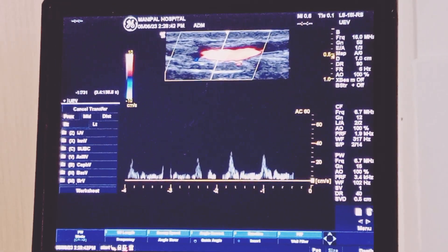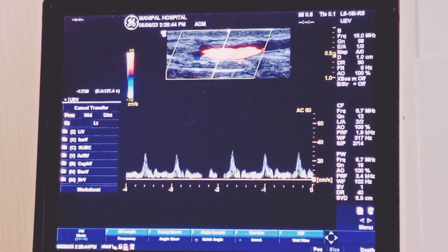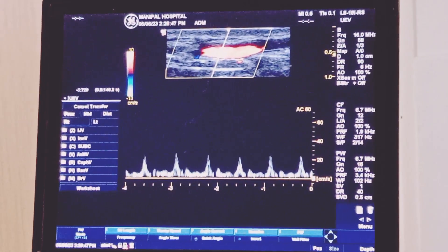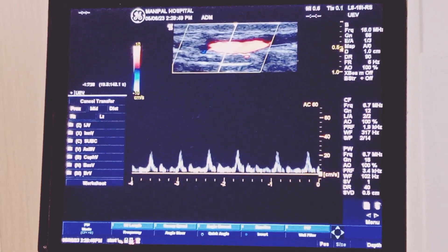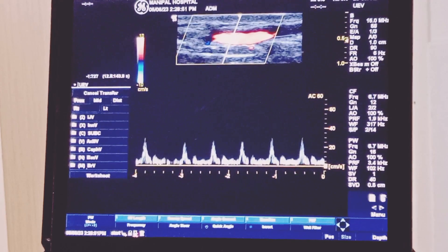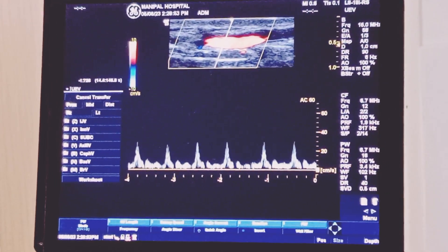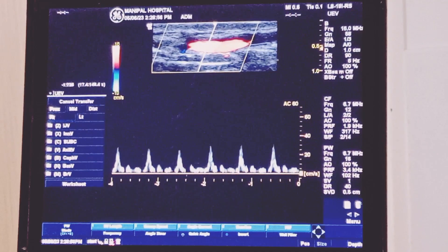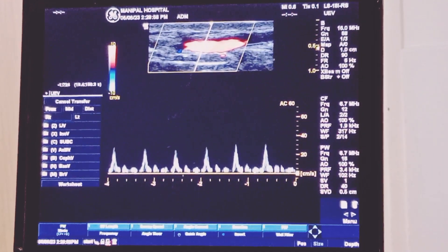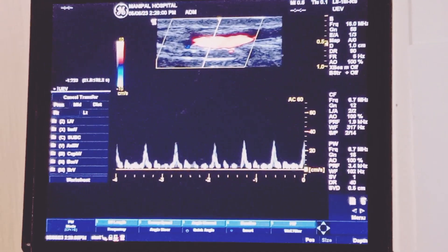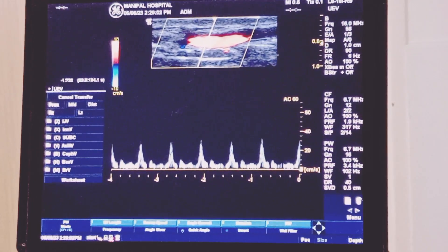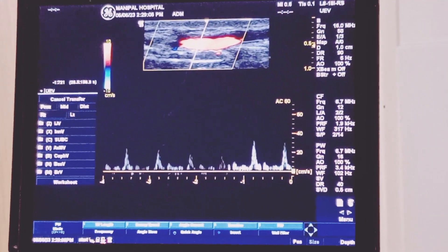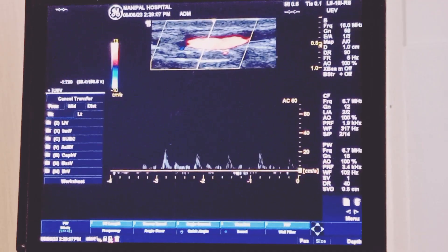Even on the sagittal plane you can see the systolic and diastolic waveforms — this is how you identify the radial artery using Doppler ultrasound. In summary, on the transverse plane and on the sagittal plane, you have to identify the artery and make sure you get this waveform — this is a very important prerequisite before you cannulate the radial artery.